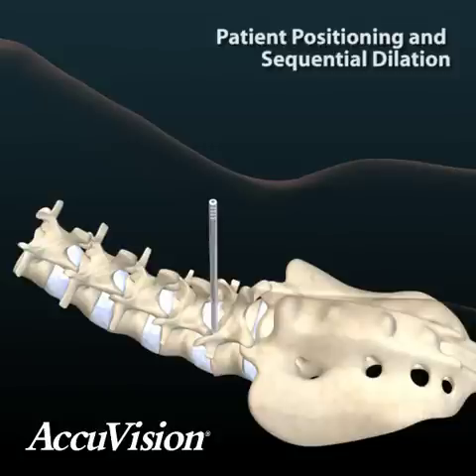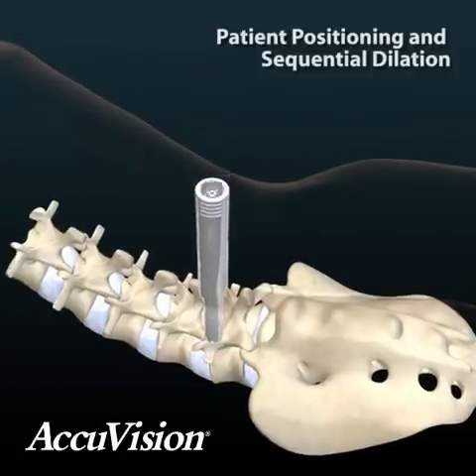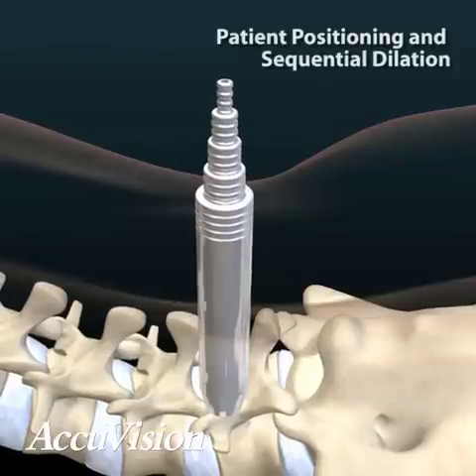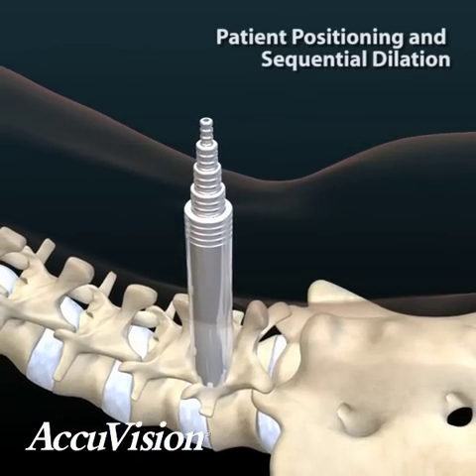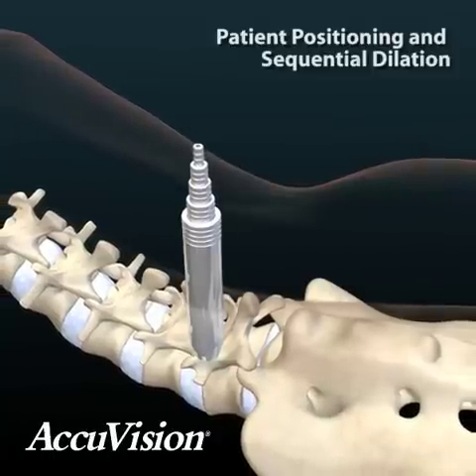Sequential dilation of the surgical incision continues until all 5 dilators are docked to bony anatomy. A gentle sweep at each stage of the dilation process can be performed to further aid in removing soft tissue from the bony anatomy. The dilators are labeled with centimeter depth markings to allow the physician to determine the blade length necessary to achieve the proper exposure for the procedure.